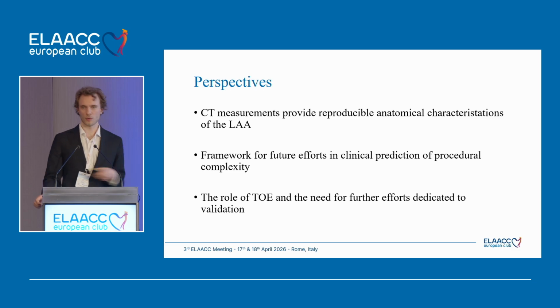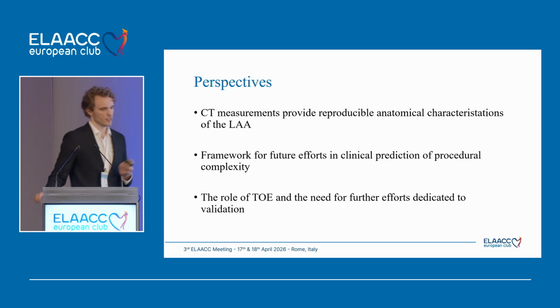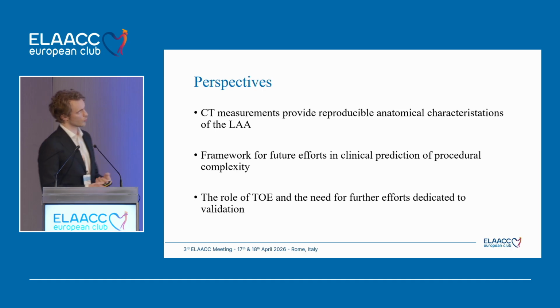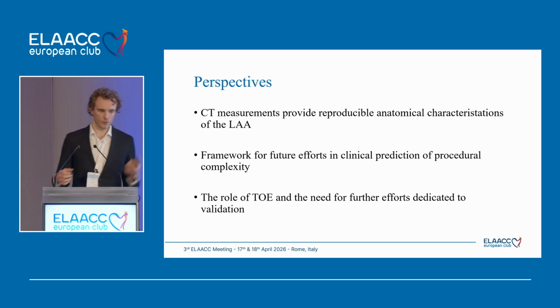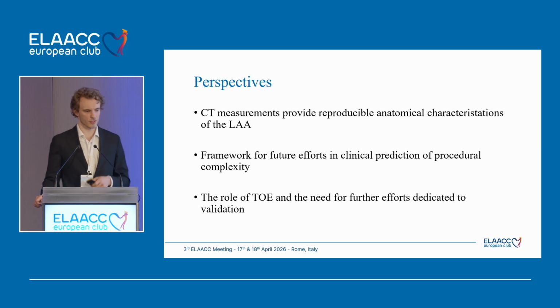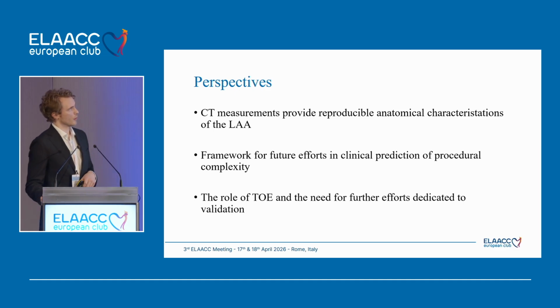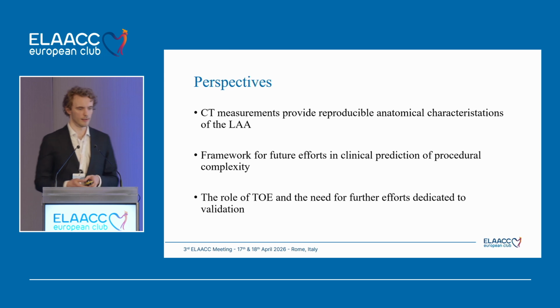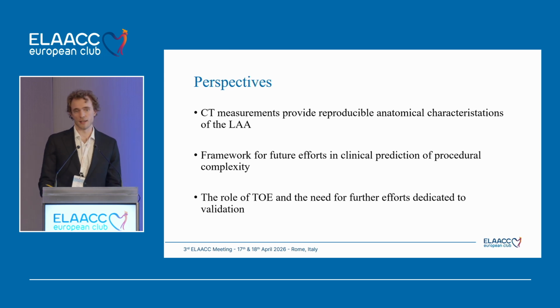So how does this work contribute to future efforts in the field? We find that CT measurements in general provide good, reproducible anatomical characterization of the left atrial appendage. And we hope that the efforts of this study may be able to build upon the growing framework for future efforts in the prediction of challenging cases and for subsequent clinical outcomes.